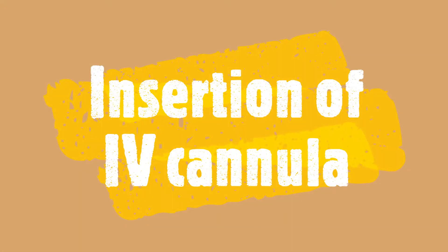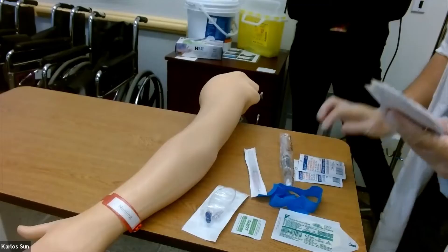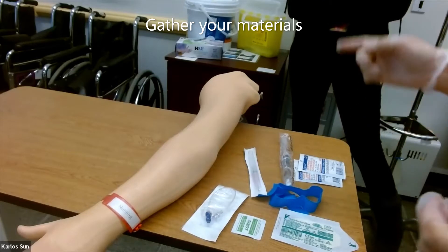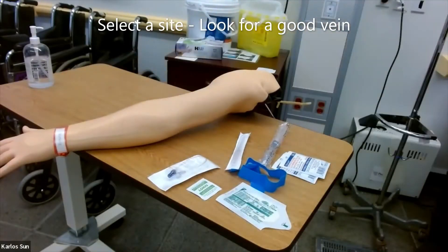Hello everybody, this is Carlos. Today we're going to go over insertion of IV cannulas. Gather your materials and select a site.